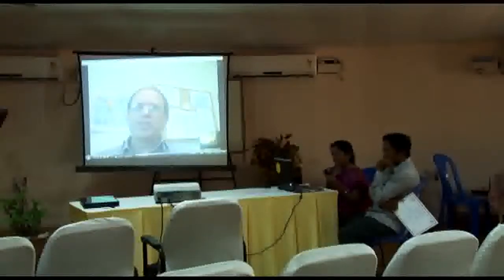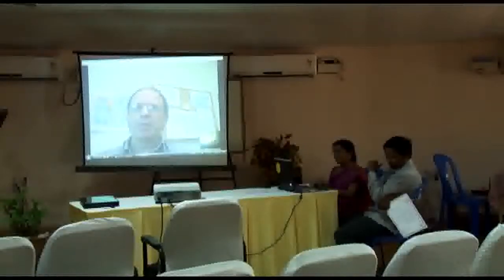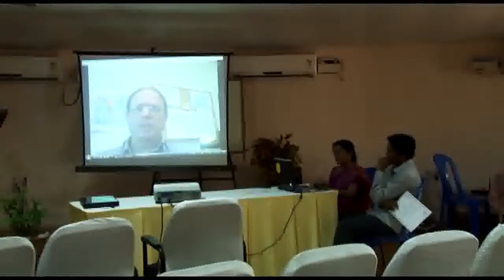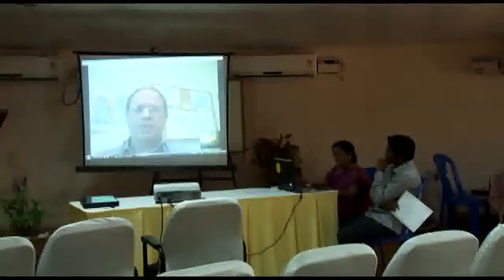Okay. Becker's nevus, typically, it's also stubborn, resilient pigmentation. The approach is typically to use Q-switch laser, and some IPLs just for the hair, if there is involvement of hair, of course. So these are all multiple treatments that should be done for this type of lesion. And typically we see quite nice shading off. It depends, of course, whether it's large or smaller, but it's not easy to clear it altogether.